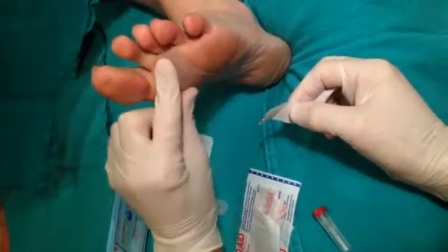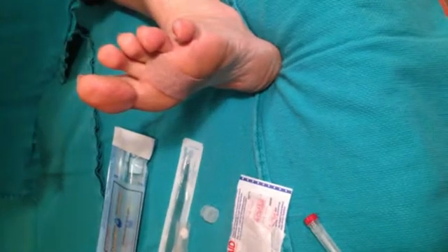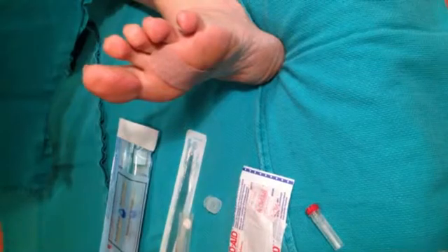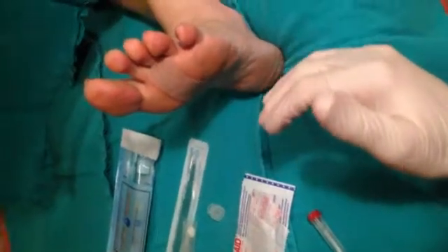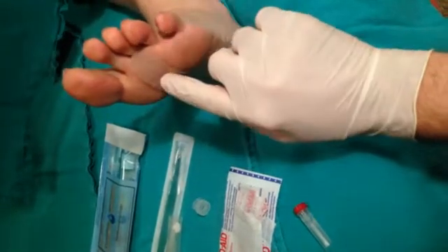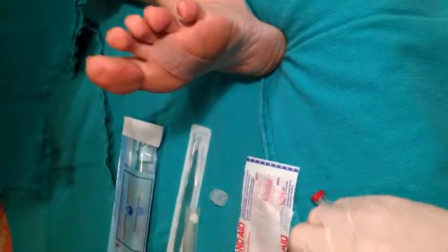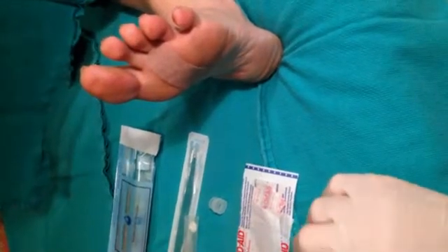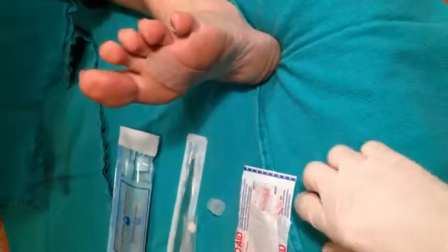Then we apply the gauze occluding bandage. The instructions to the patient at this point are to not touch this in any way, shape, or form. No source of water should touch the foot until approximately one to three hours before the return visit for the debridement. Then the patient will need to soak their foot in warm water for 15 minutes — in a bowl or a tub. At that time, the solutions will uptake the water and cause a swelling and breakdown of the hyperkeratinized tissue, which we will see in approximately 24 hours.